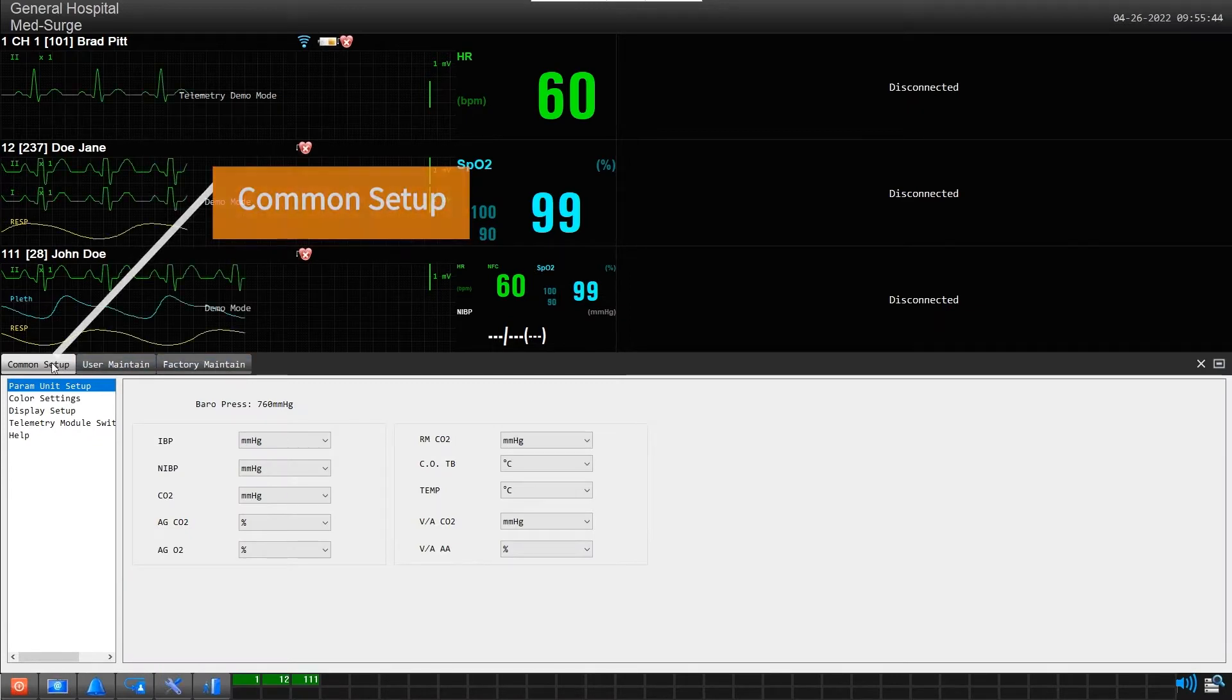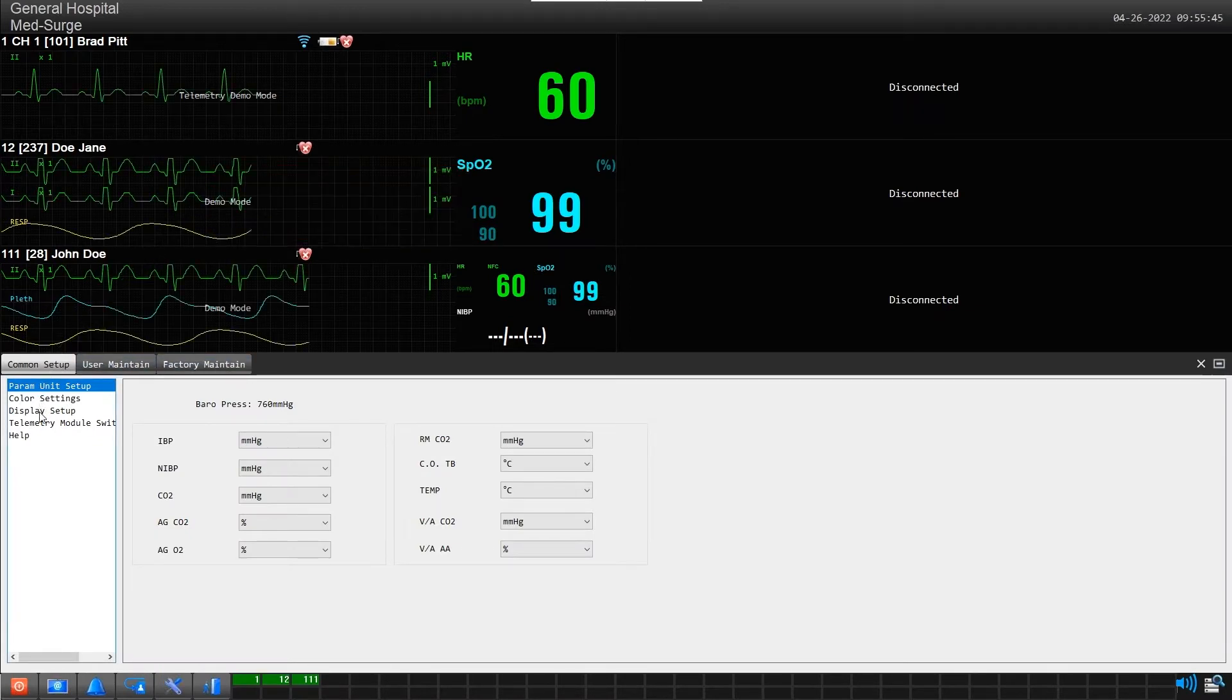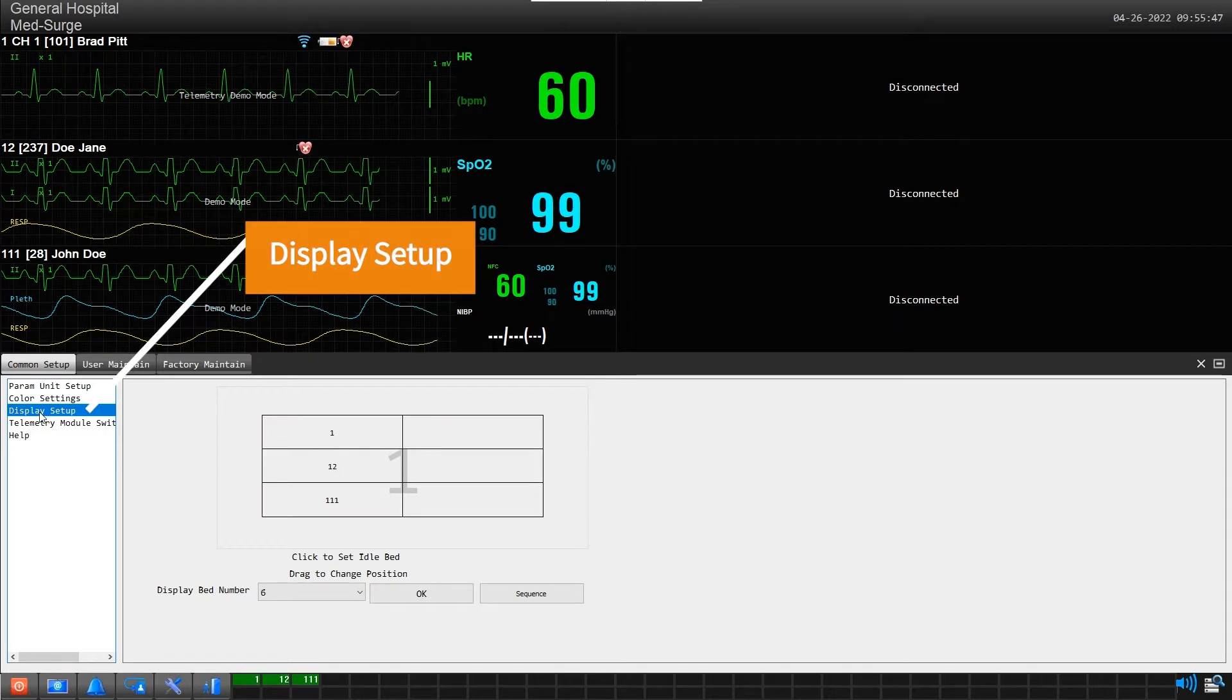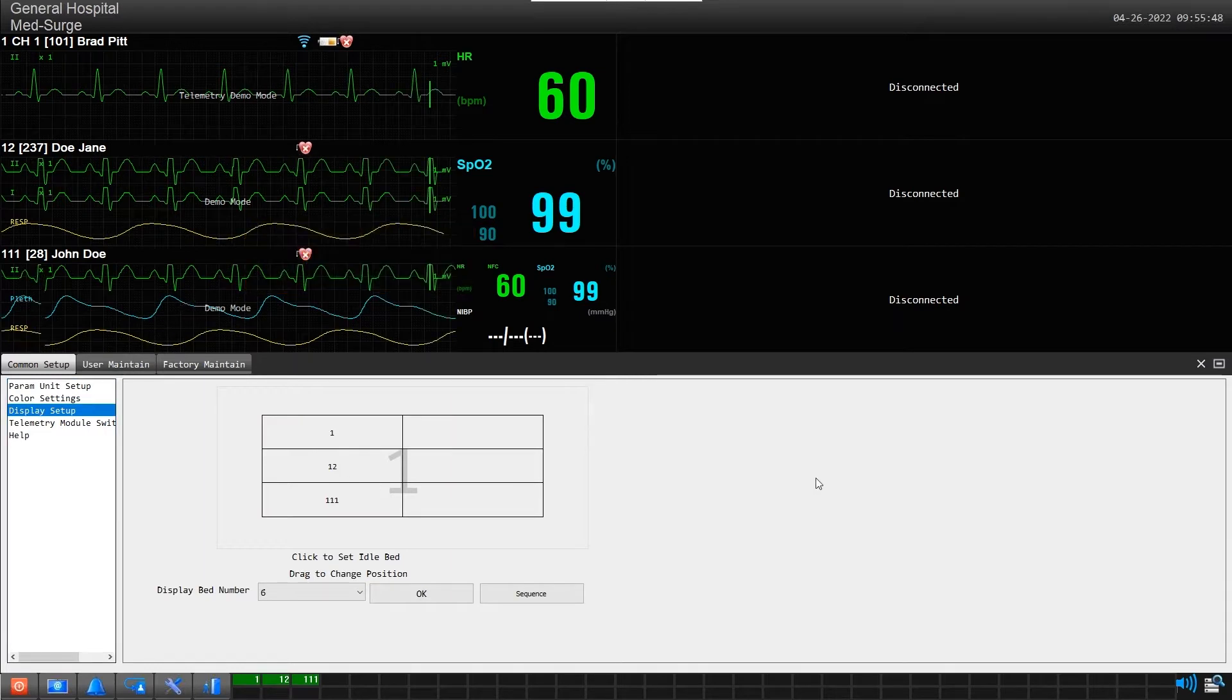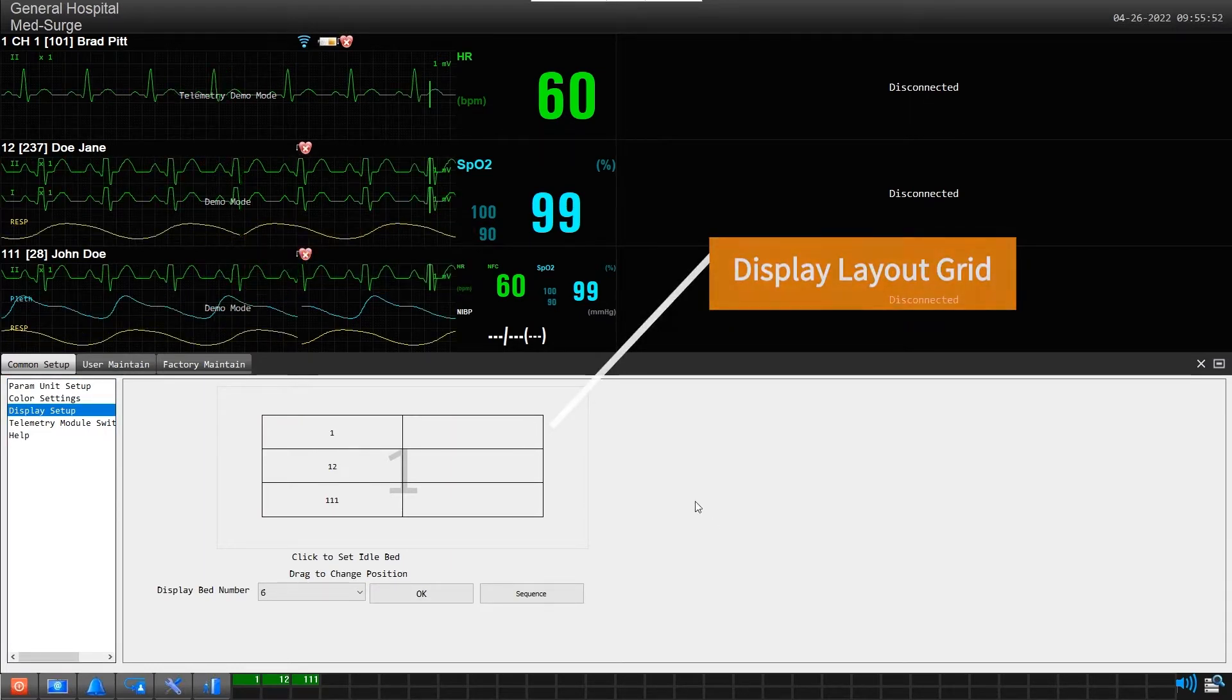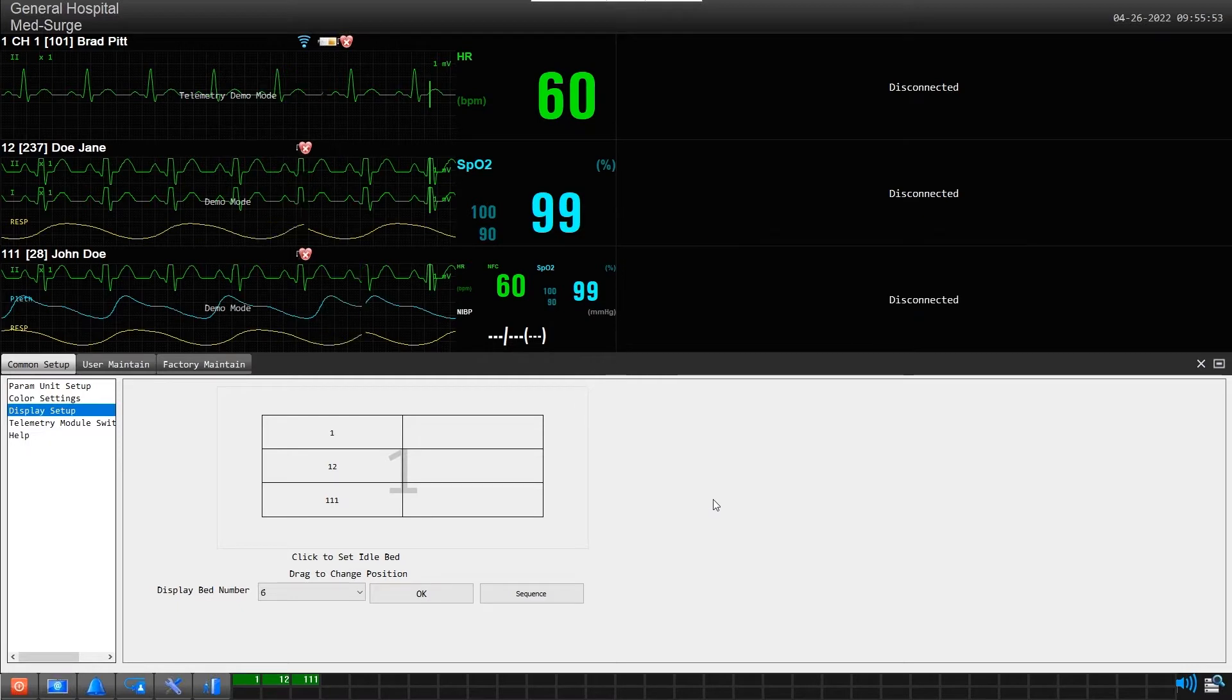Now find and click on display setup in the option list below. You will see a display table layout of our current screen capacity setup for 6 patients.